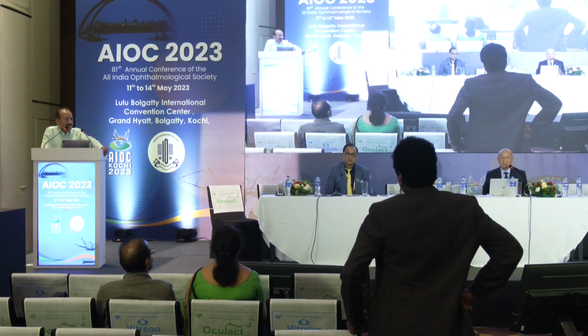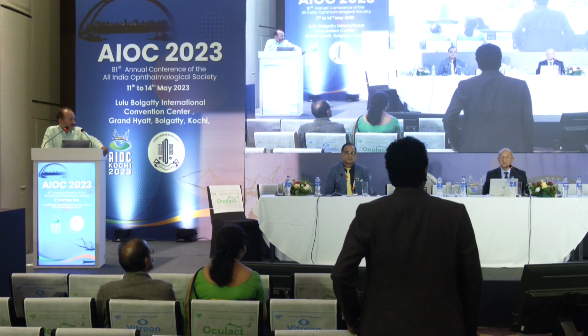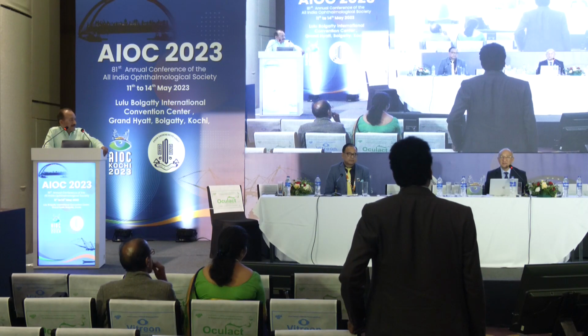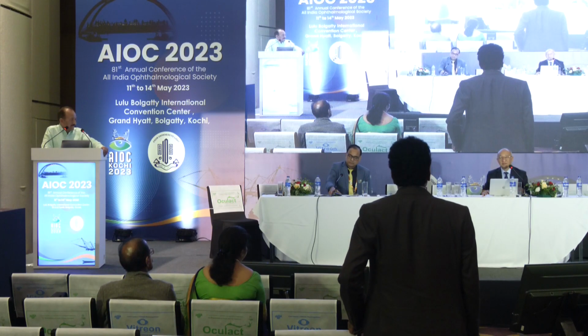What I do, all RK patients, I make them sit in my ray tracing technology. I do aberrometry analysis, tell them your cornea is totally aberrated. I show them first, then do a surgery, because they think they are normal, they could see better with the RK. Now you'll see better with the cataract surgery also.